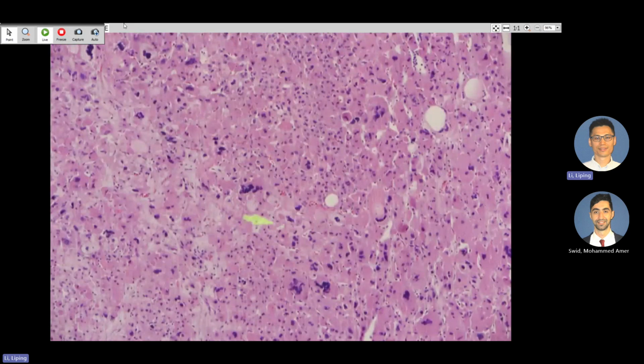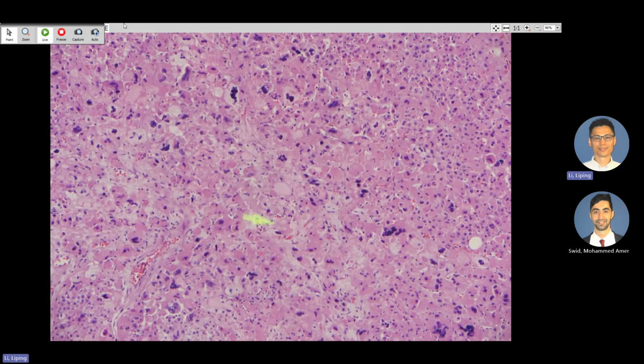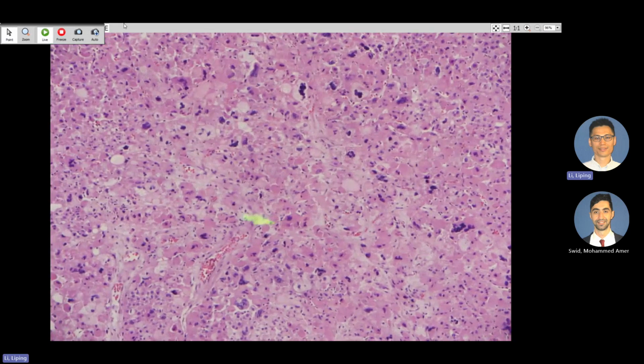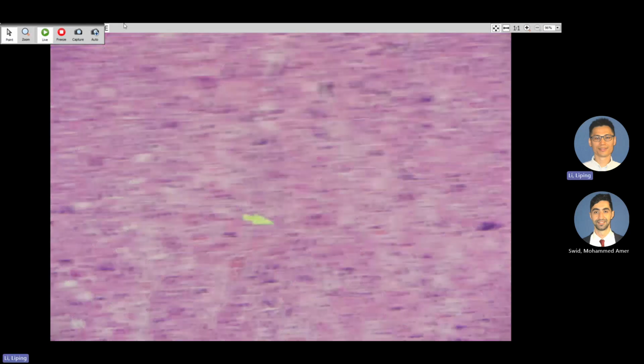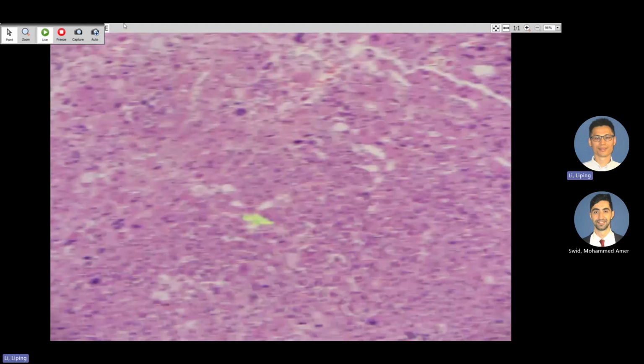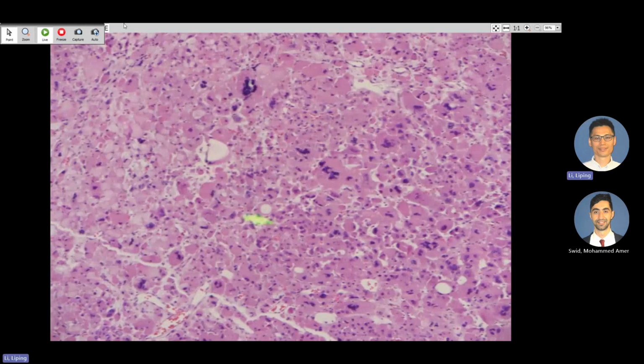But because they have some minor criteria, maybe the pleomorphism, because if this was not from an adrenal gland and was another kind of tumor, you would think, oh, pleomorphic tumor cells. But for this one, you sign out just borderline. You just could not tell. Okay, then why? Cortical adenoma borderline. Non-malignant. Yes.